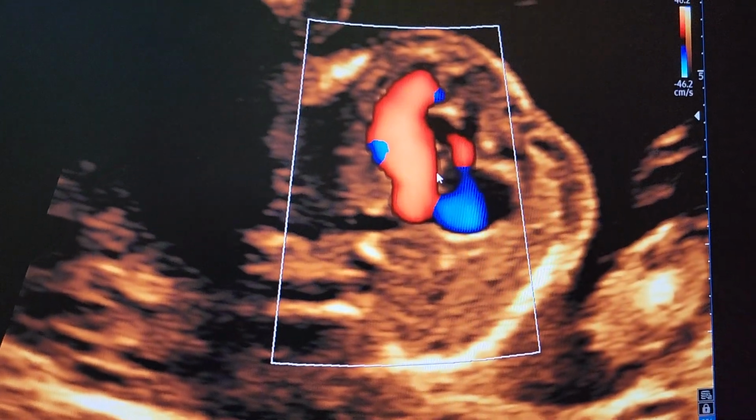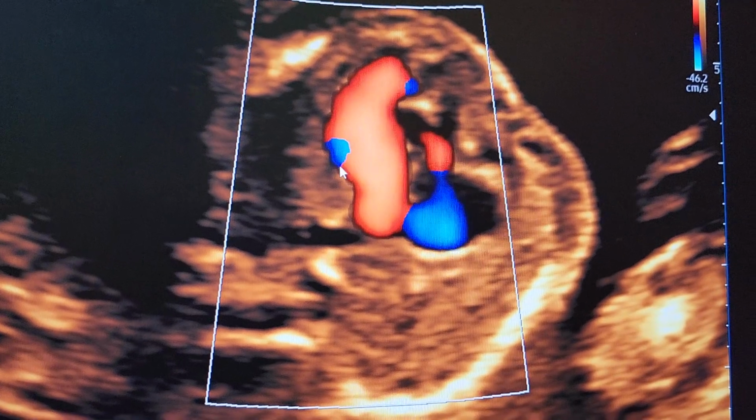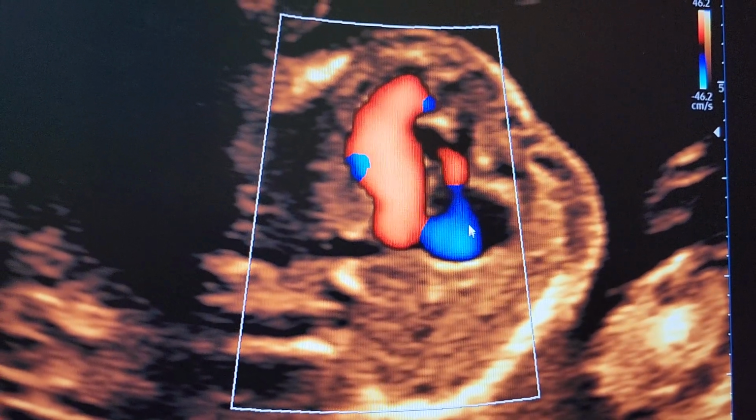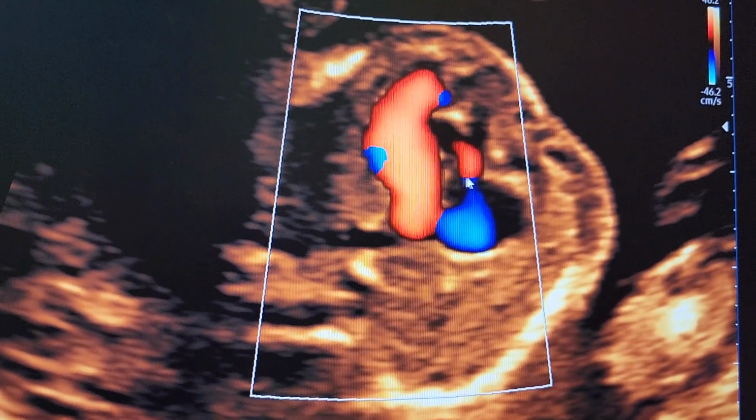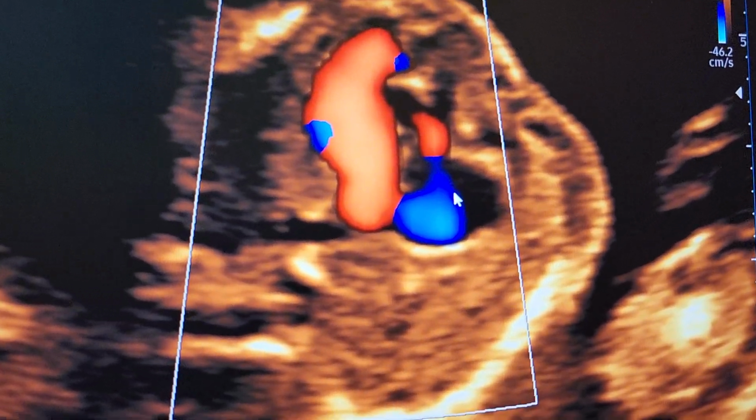So in this 4-chamber view, you can actually see that's the LA, LV, wide open mitral valve. That's RA, RV, narrowly open tricuspid valve. The red is the inlet taking blood from RA to RV.